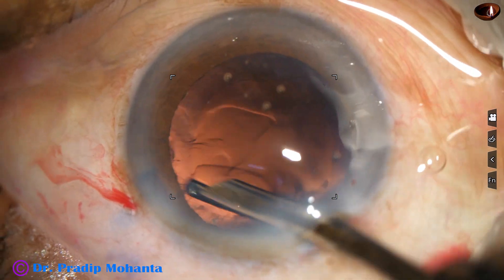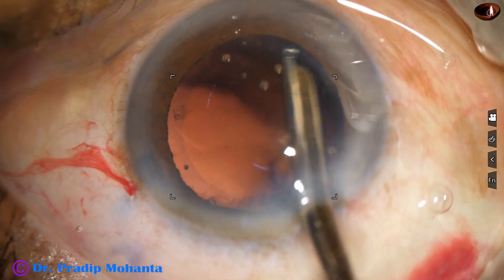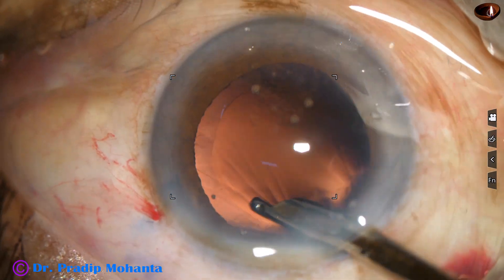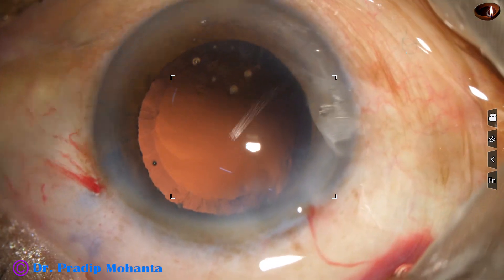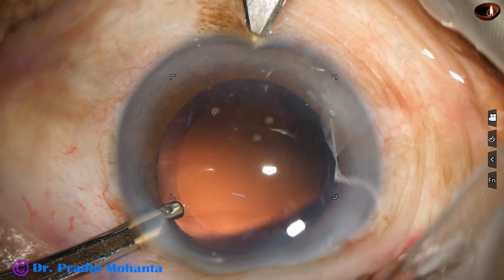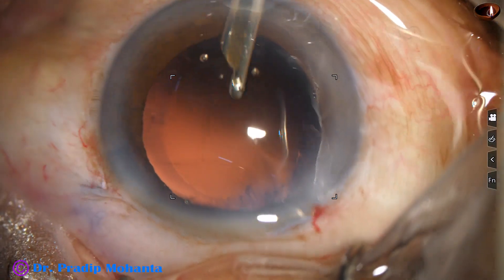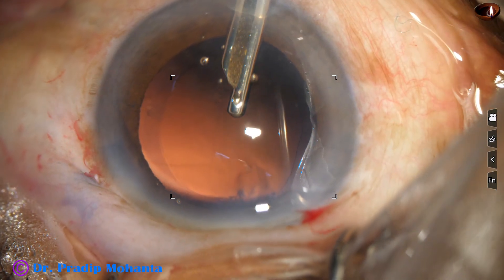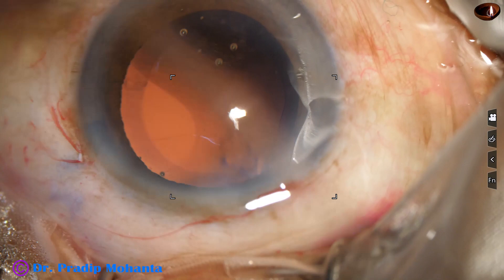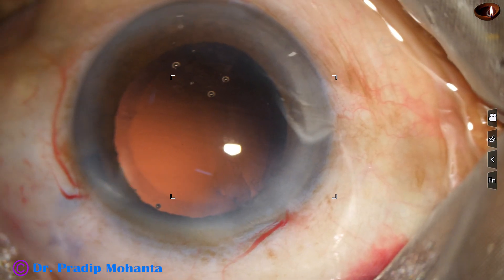Now I am using a Simcoe cannula to manage the cortex. We can use a coaxial I/A, but this is a safer instrument. This side port is very small — the Simcoe is not going in. I make another side port at 7 o'clock to remove the cortex from 10 o'clock to 1 o'clock.